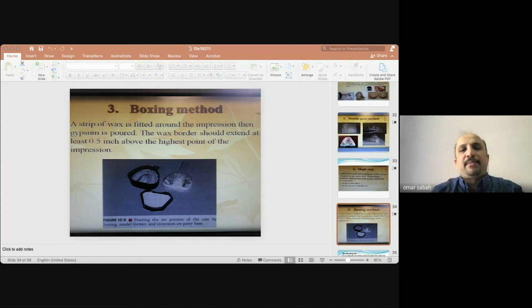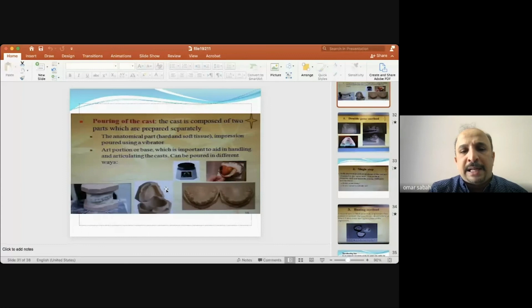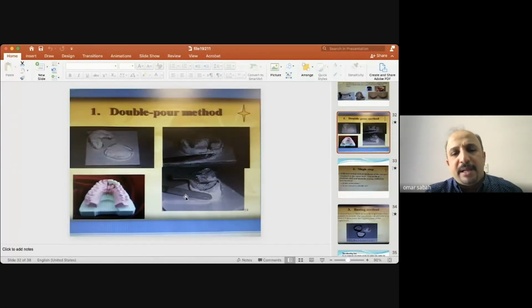ولهذا لازم يعني ننتبه على السيتنج تايم مالتنا، وتجيب البيس ونصب البيس اللي هي نحن الصوره اللي وصلتكم بطريقه السنجل تكنيك، وعندك التو ستيب تكنيكس اوكي. فراح نستخدم الفايبريتر، راح نخلص منه العمليه. بعد عملنا البيس بالبلاسترز، بعدها نفتح التري وفينيشت. هسه نحن حصلنا على الفاينل ريزلتس والفاينل بوزيتيف مع البيشنتس.